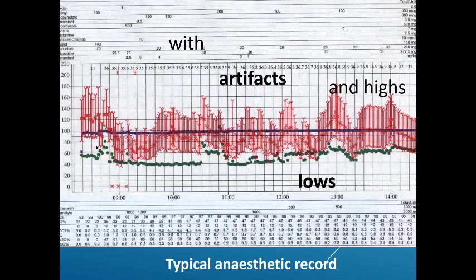And, for example, the heart rate measurement is very robust. Heart rate is taken from 3 sources: the ECG, the blood pressure measuring system, and the pulse oximeter. All 3 would have to fail. If they did, there would have to be a 5-minute recovery period before full analysis could continue.